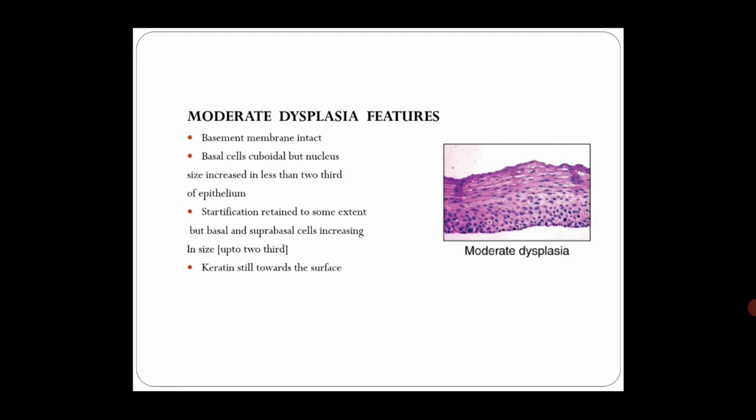Okay, so that is the only difference. The features are the same, but the extent of change in the cellular presentation will be more in case of moderately dysplastic epithelium. Then again, keratin will be towards the surface.